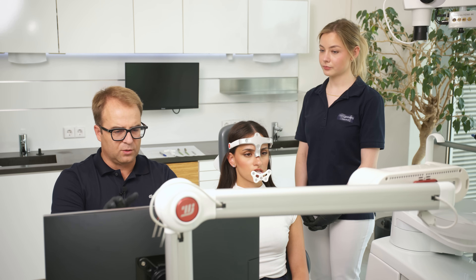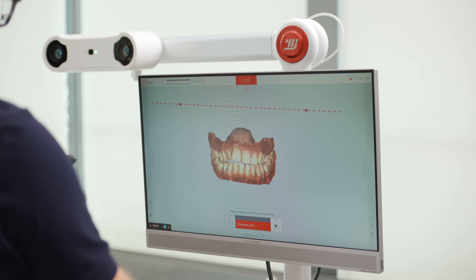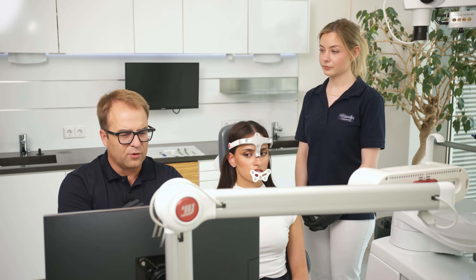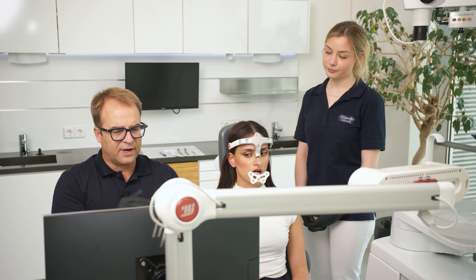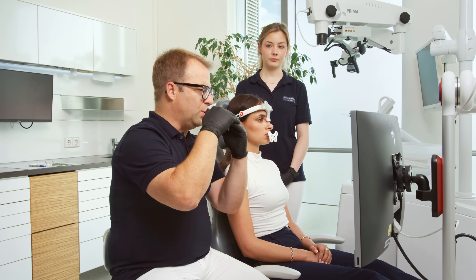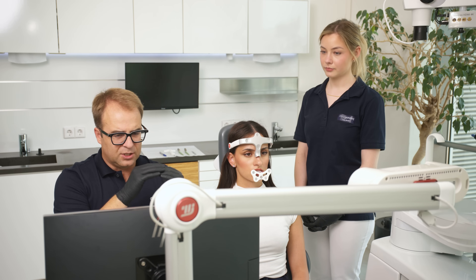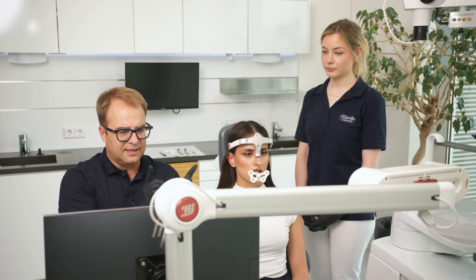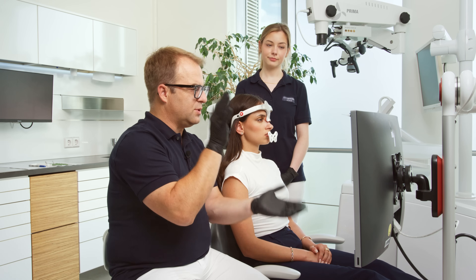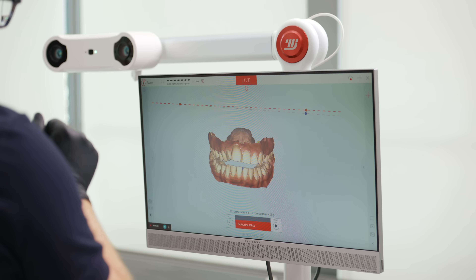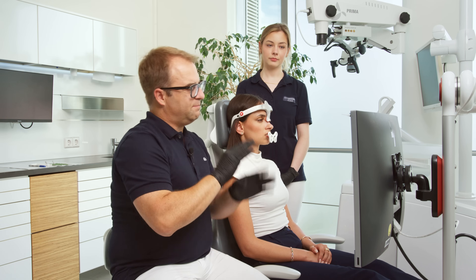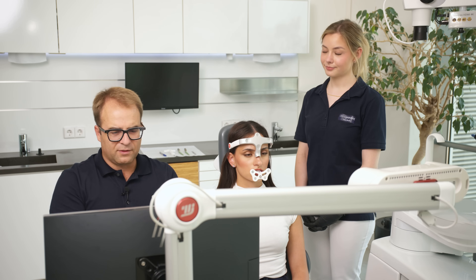During the practice run, I guide the patient through all movements: jaw forward and backward for protrusion, lateral movements left and right guided by the teeth, open-close movements, and grinding or chewing. I also ask for small up and close movements. That was the practice run before the recording.